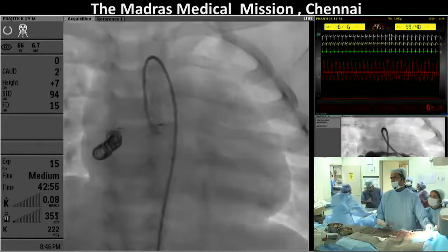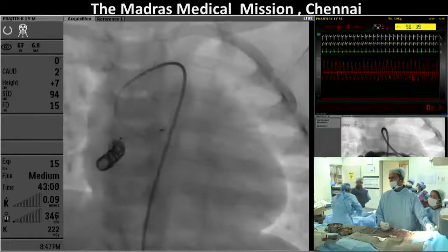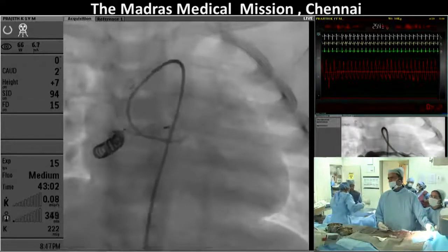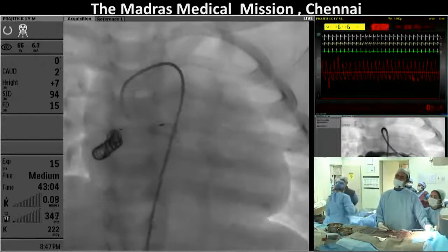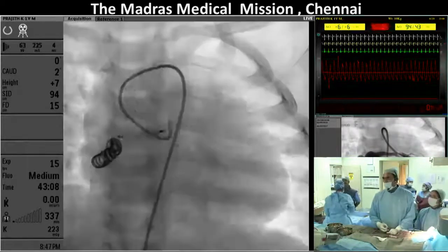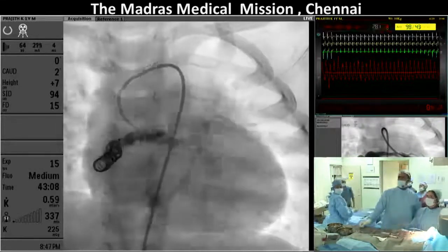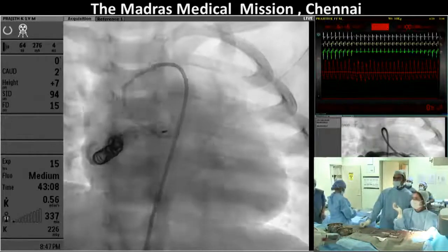It's going to require significant catheter skills to engage this left coronary with this catheter. Unfortunately, having this is going to require skill. In which case, Mansur, you would lose on both counts. You're in there now. Yep, you're in. Excellent. And then don't pull it out.